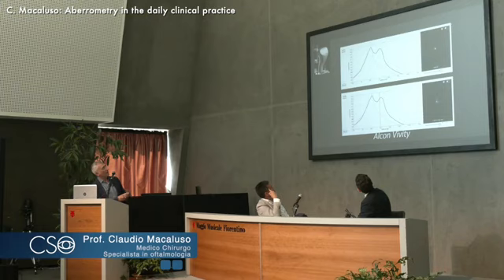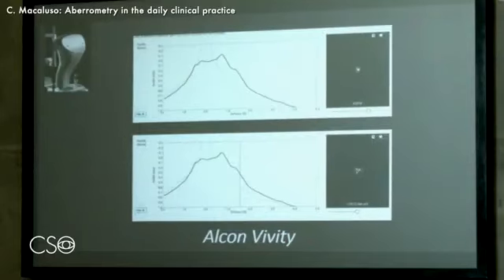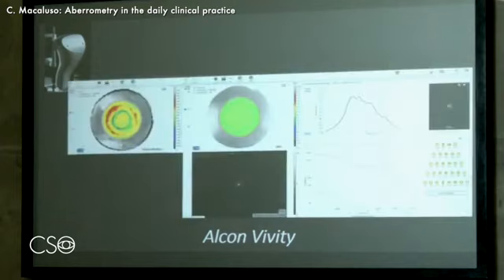You see it's very high at 0 distance, but it stays pretty good down to -1, that is 1 meter, and even pretty good at -1.5 diopters. So this is a good result for an extended depth of field IOL. And this is pretty reproducible in other lenses, other patients. We see this broad peak in that area that gives good visual results.